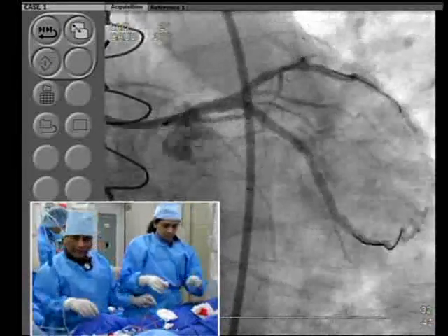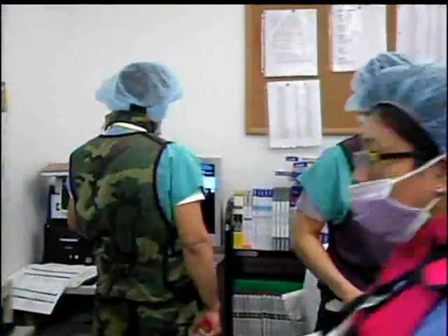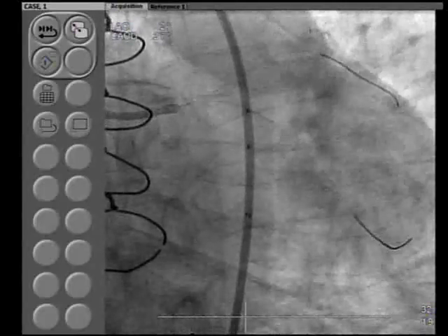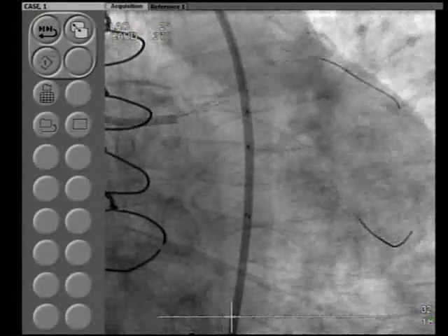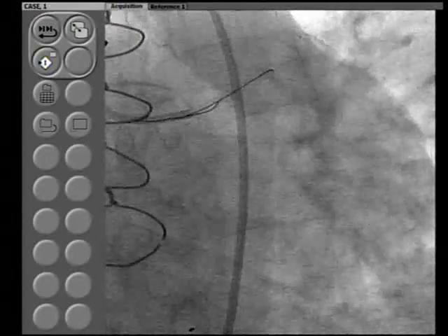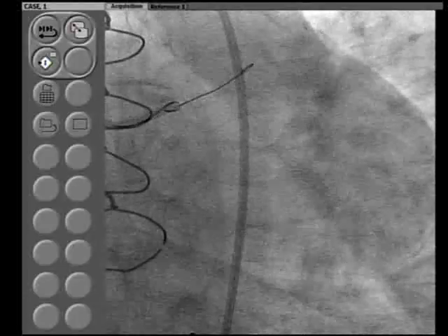Now we are going to do IVUS. Of which arm? Both arms? Yeah. Okay, now ready to take a picture. Now this is, again, always aspirate when you're taking your balloons out, always aspirate, basically the wires, what happened to the wires, which is fine.